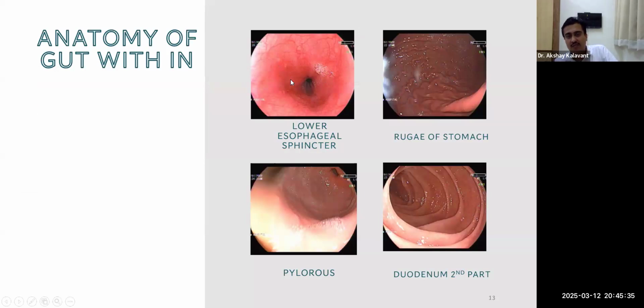I'm trying to give you an example of the regular pediatric surgical scopies or laparoscopy so that you can grasp it. Once we do a cystoscopy, the bladder neck opens up with our infusion of the saline. Similarly, once you do an insufflation of the air, it opens up. And when you enter inside, this is the gastric rugae, which is normal.